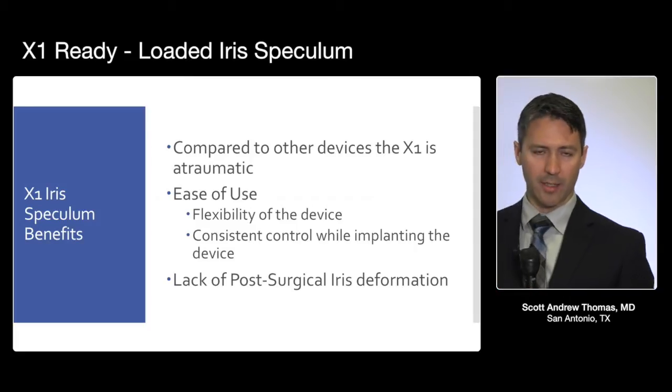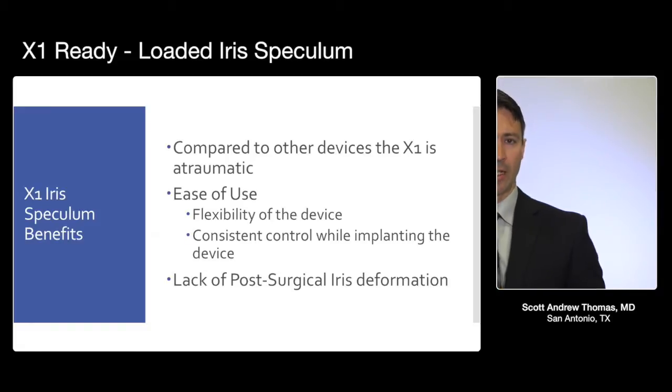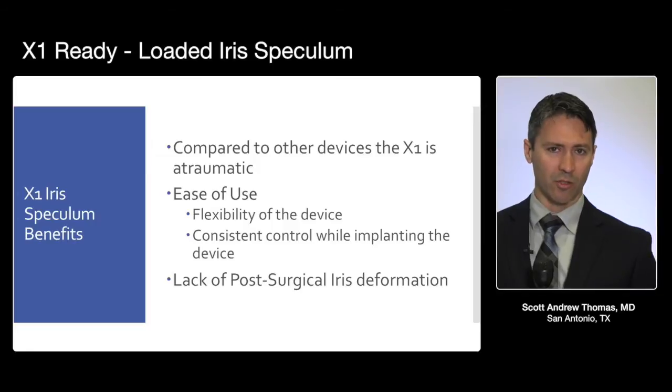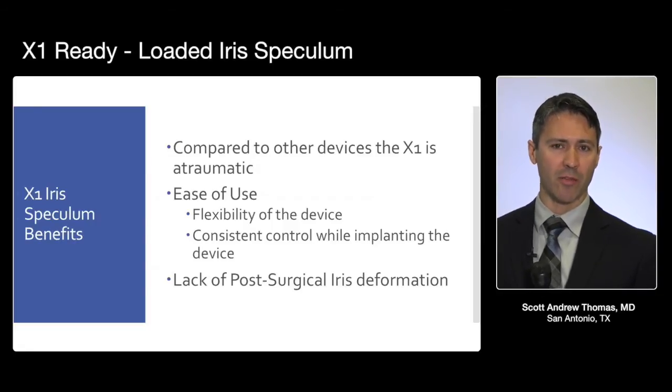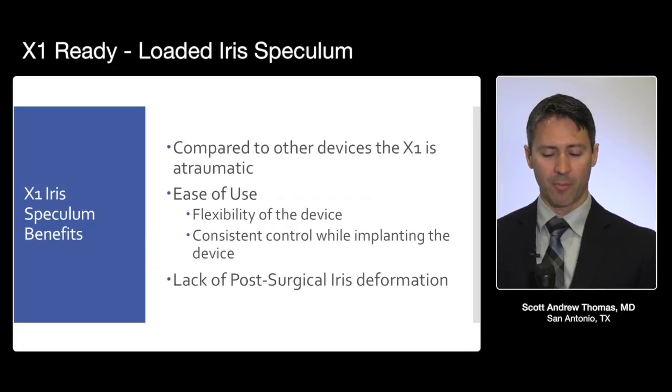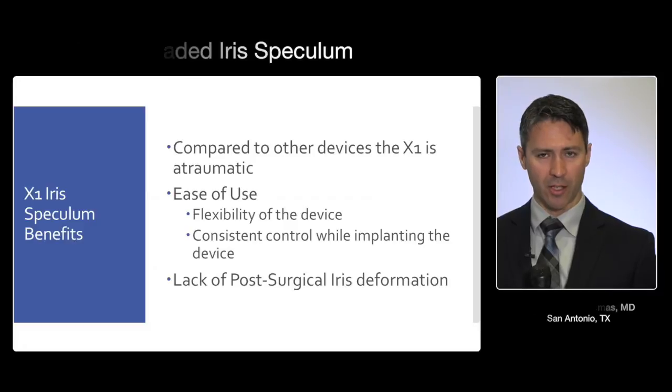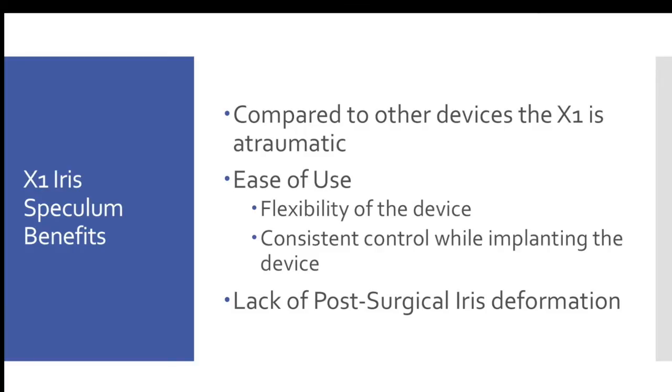As that case demonstrates, the ring provides an excellent retraction of the iris. It leaves the iris undisturbed — there is no excessive traction on the iris root. The pupil margin is maintained and can resume its normal round physiologic configuration. The device is very easy to use; it's intuitive and has a very short learning curve.